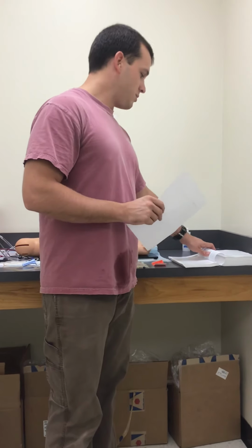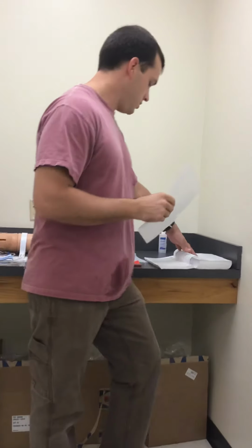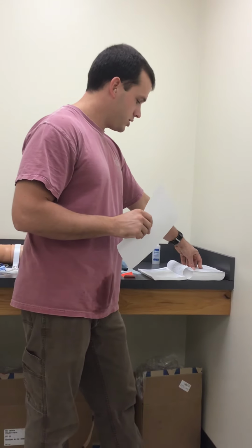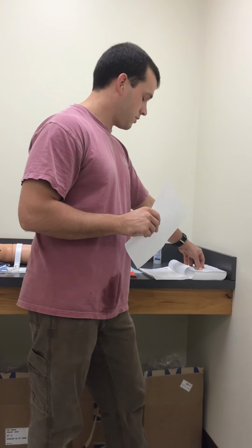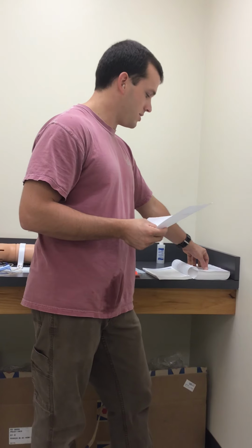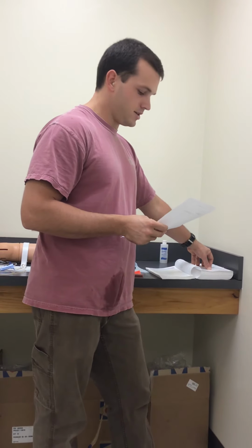I'm going to check compatibility, and for this particular patient, I know that he has D5W running as his primary. Make sure that it is compatible with D5W. I'm going to check rate of administration. For this drug, a single dose needs to be given over 30 minutes, and for 30 minutes, that is 200 milliliters per hour. Or for our case, since we're doing it by gravity, it will be 33 drops per minute.